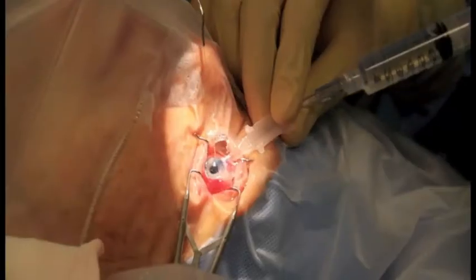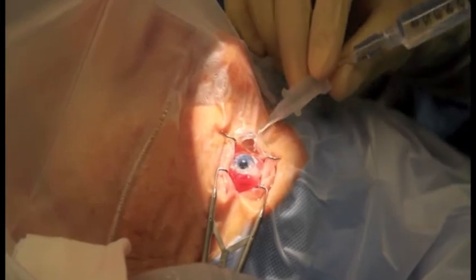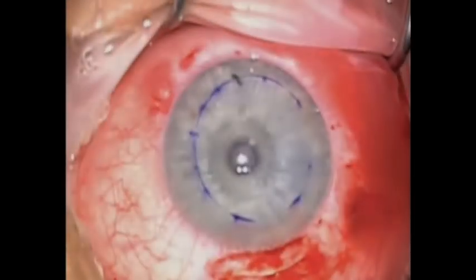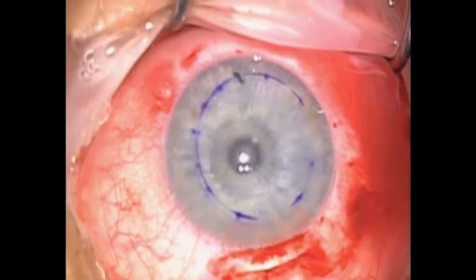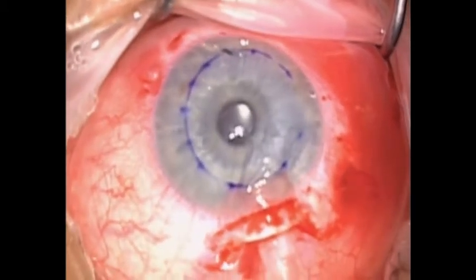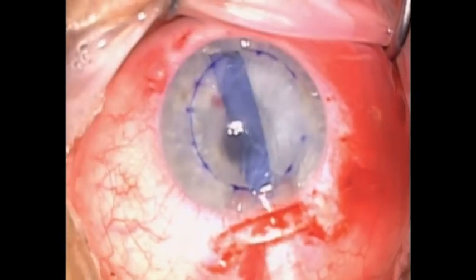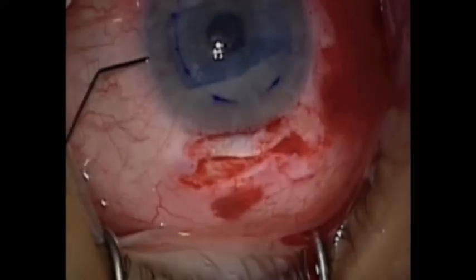The device can be inserted into the anterior chamber through a standard 2.75 mm keratome incision. In this case, a scleral tunnel incision was used, but a clear corneal incision can also be used. The tissue is delivered by gently depressing the plunger of the 10 cc syringe. Be sure to continue infusing as you remove the device.